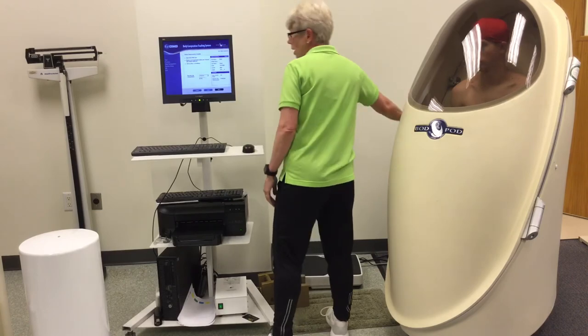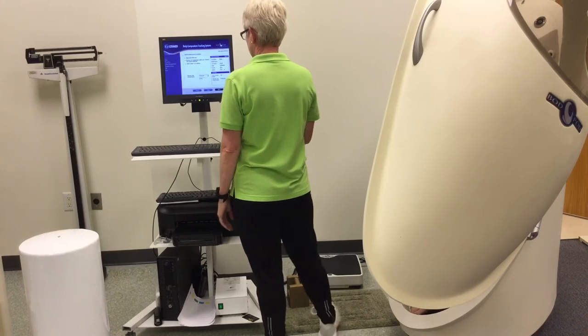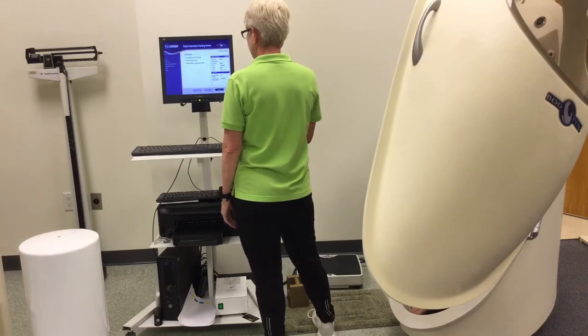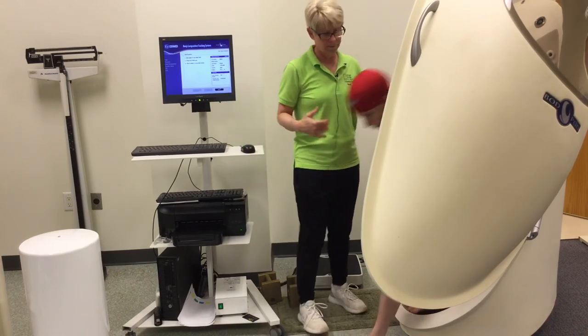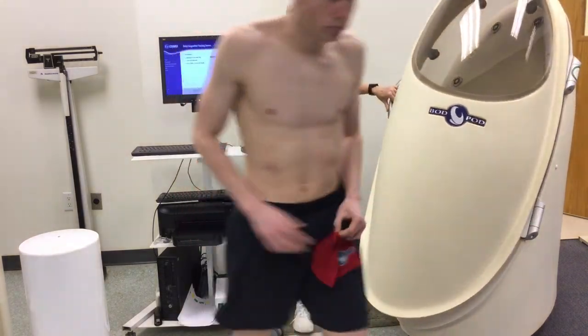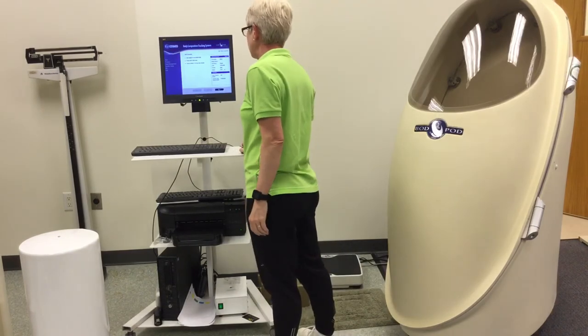It says open the bod pod and review the thoracic gas volume selection. I'm going to click next. You can go ahead and exit and take off the cap.